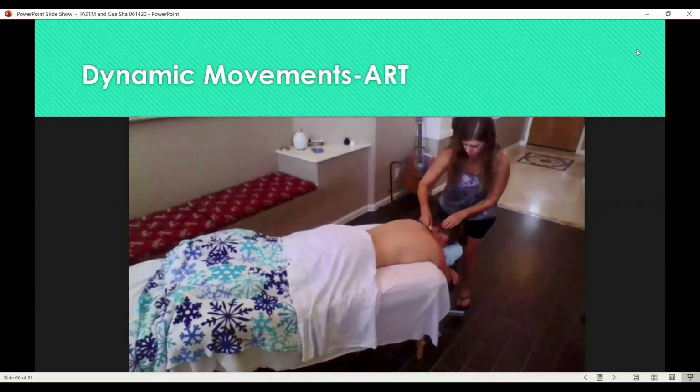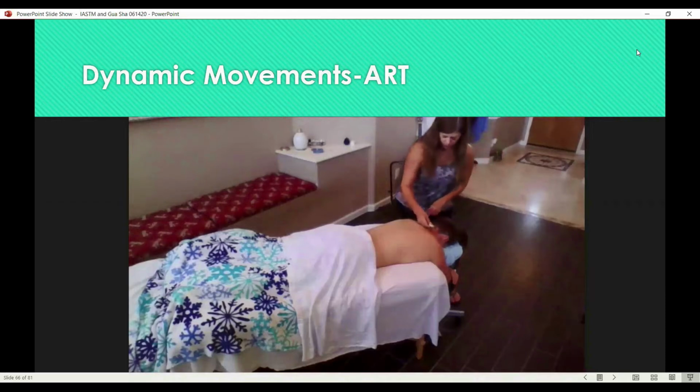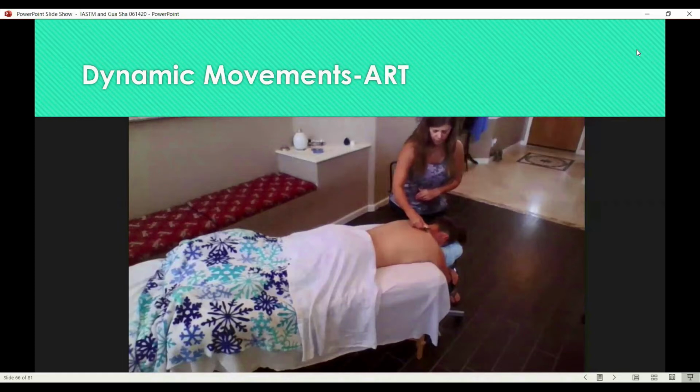I turn around and do the lower ones. And then we can have our client make some motion. So here, she's going to extend at the neck. I engage on the tissues, and then she brings her head down. Not everybody has the strength to do this, but if they're able to, this is one way you can do it on the massage table.